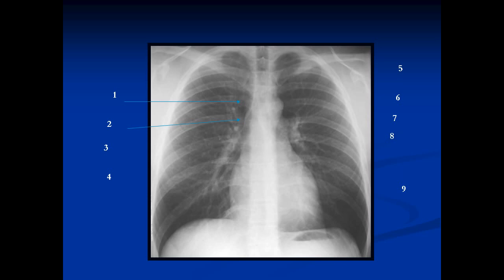The next structure we'll talk about is this little almond-shaped structure just above the right main stem bronchus — this is the azygous vein. The azygous vein is an alternate pathway for blood to flow from below the diaphragms up into the heart, and it actually empties into the superior vena cava.